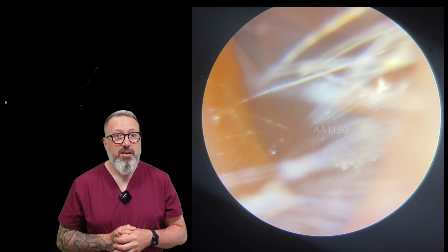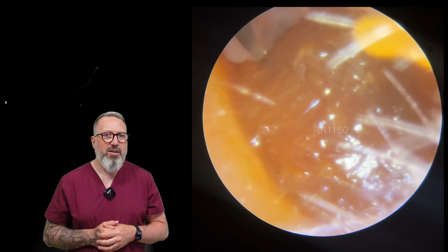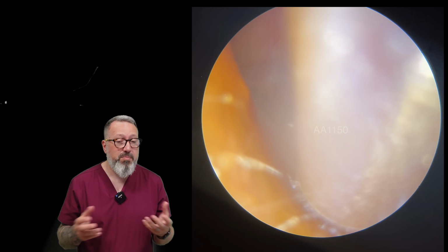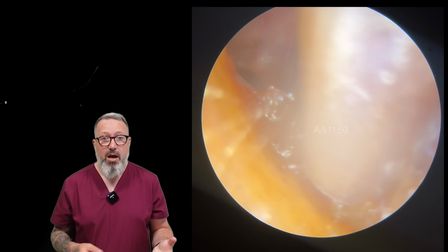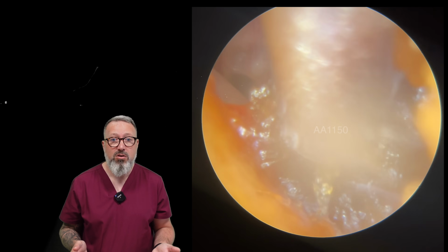Patient hearing much better. Not so much on this side. You know, just a little blob right at the entrance. And I would normally be really honest with the patient at this point and say, look, there is a piece of wax in there. It's not huge. It's not going to cause any problems with your day-to-day hearing. Completely up to you whether you want this removed or not.